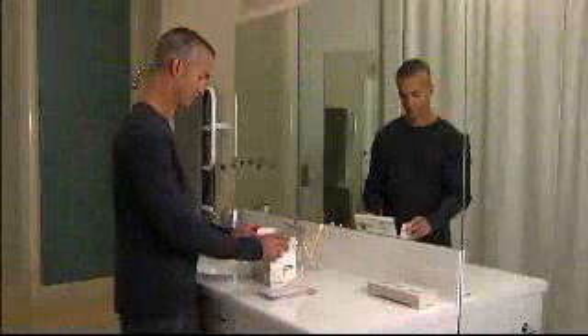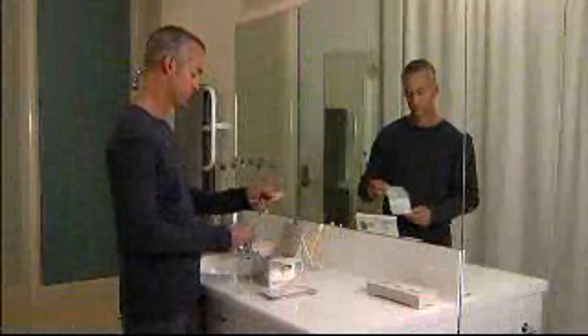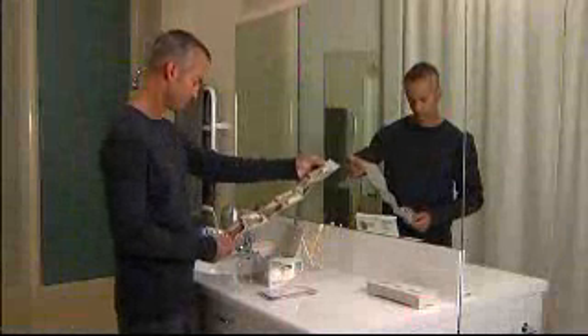Open your mask box and remove the fitting guide. Follow the simple fitting instructions in this guide until you are familiar with your new mask.